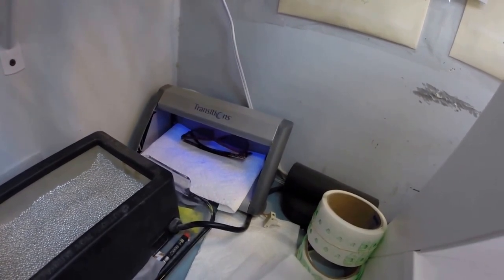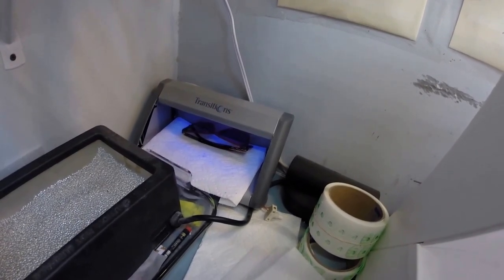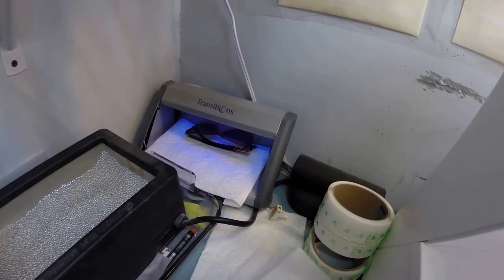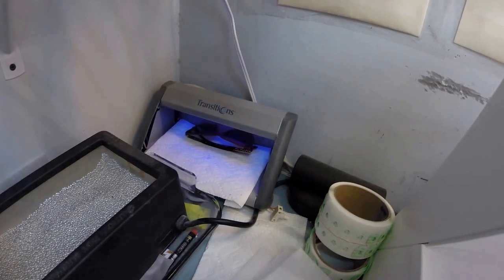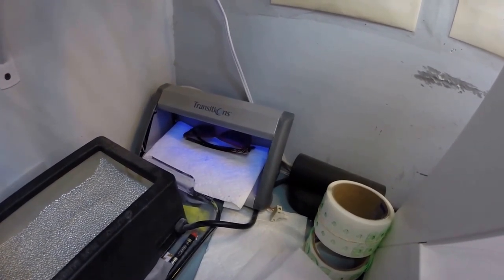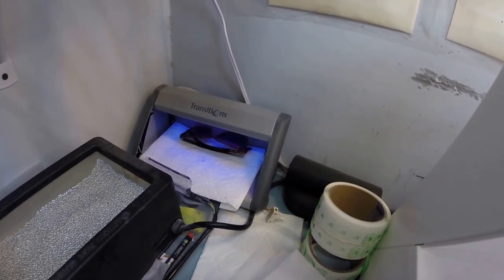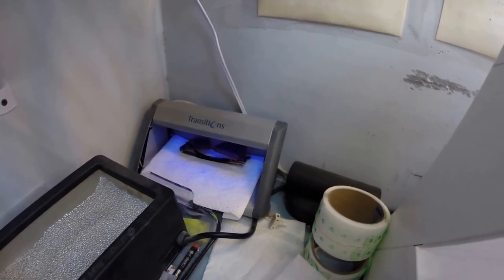Now this is important, Suzy, pay attention. All Transitions lenses will turn dark on day one. Give them 2 weeks of exposure to the sun and they will continuously darken for the first 2 weeks until they reach their final setting. After that, they will work for years with maximum performance. The only time they won't work is if you're behind the windshield of a car. Your windshield absorbs all the sun's harmful ultraviolet rays that would cause your upholstery to rot or your dashboard to crack from sitting in the sun all day. That's why they don't turn dark in a car.